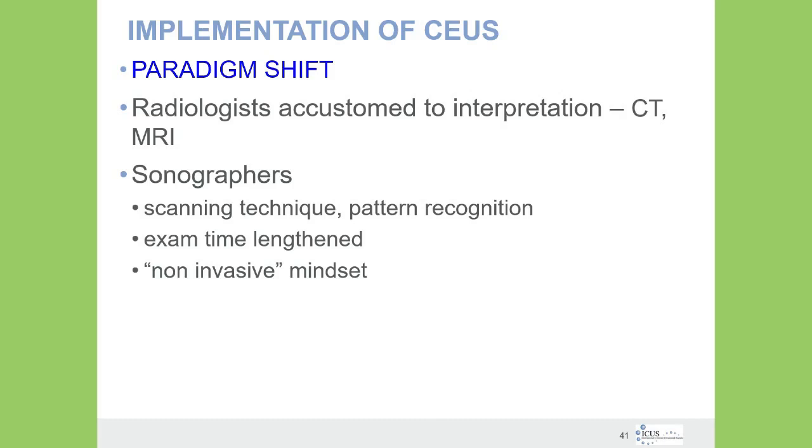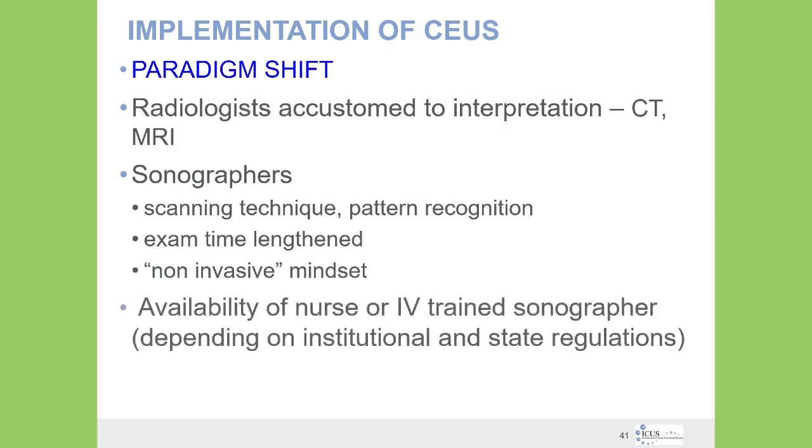And we have this non-invasive mindset in ultrasound, which is interesting considering we do endocavitary exams. We do transvaginal and transrectal, which are somewhat invasive. So that non-invasive mindset needs to go away as well due to the number of patients that can benefit from contrast-enhanced ultrasound. One of the sticking points, even after almost 20 years in cardiology, is that we need to have someone to inject.